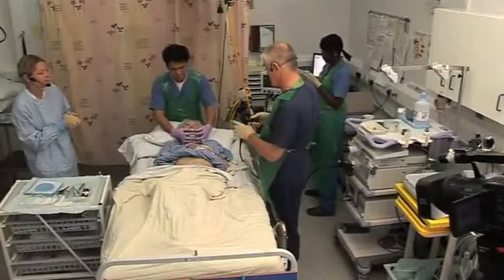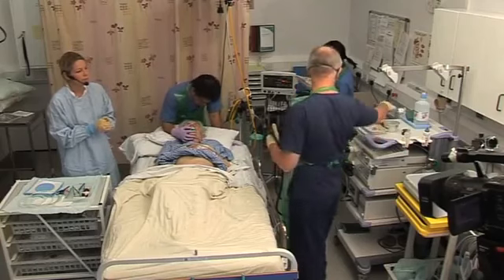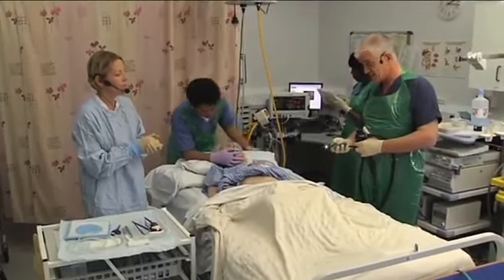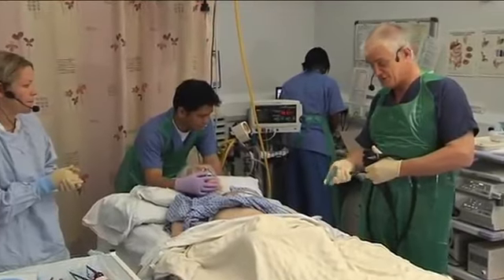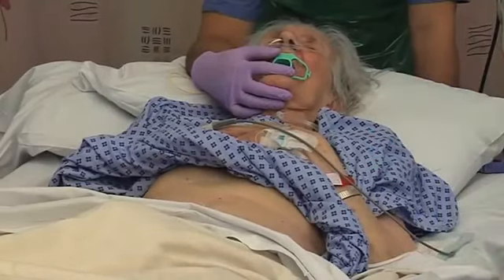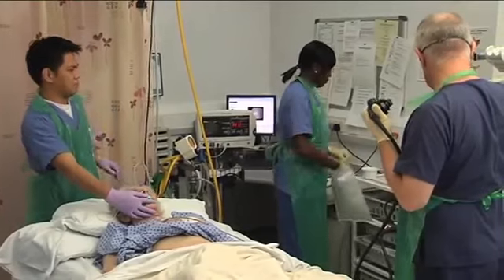This is an 81-year-old lady who had a stroke nearly 4 weeks ago now and is making a good recovery of her motor function, but is unable to swallow and has had a nasogastric feeding tube for those 4 weeks, and as she has a good chance of recovery, it's reasonable to place a PEG. So she's had very minimal sedation, 1 milligram of midazolam. I'm just checking my scope first, make sure everything is working.